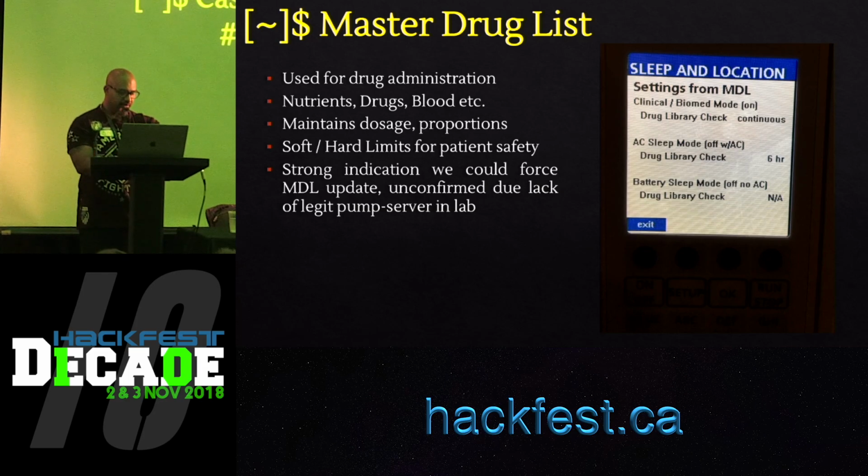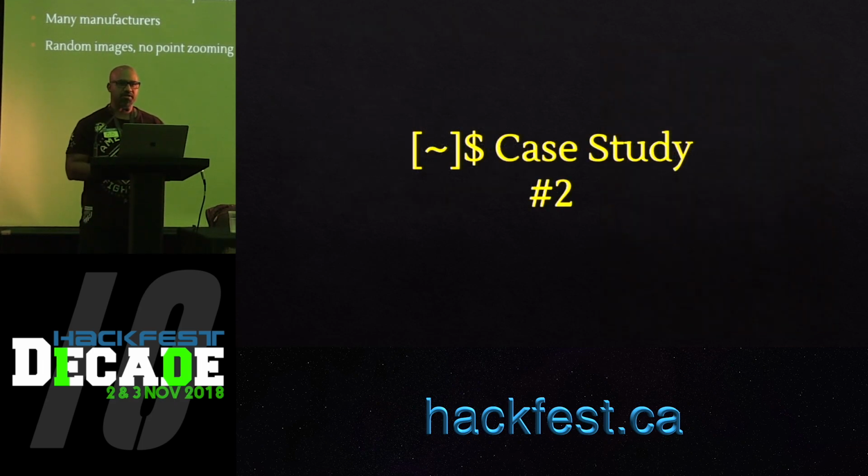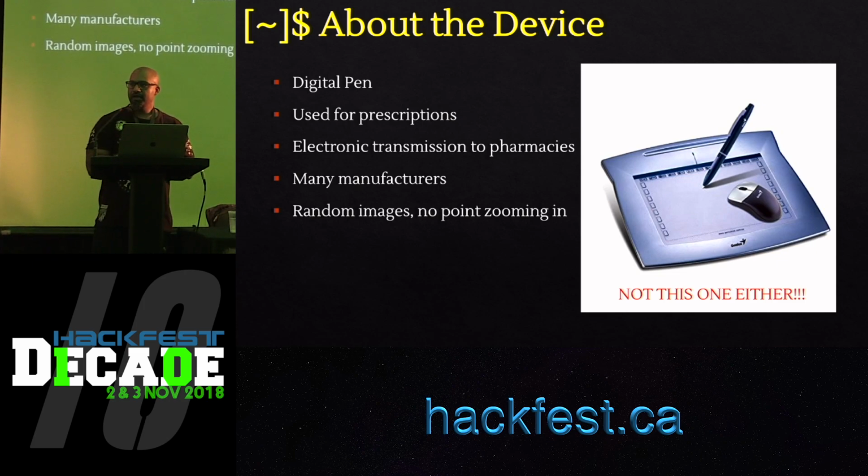The second device that we looked at was a digital pen, and the doctors would use it to write prescriptions electronically. So think of it as a glorified fax machine, because doctors would write a prescription with it. It will electronically be transferred to different pharmacies. And the idea is that by the time the patient reaches the pharmacy, they would already have their prescription ready for pickup. So these pens are, again, manufactured by multiple manufacturers.